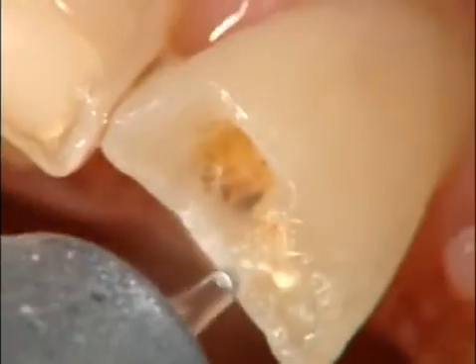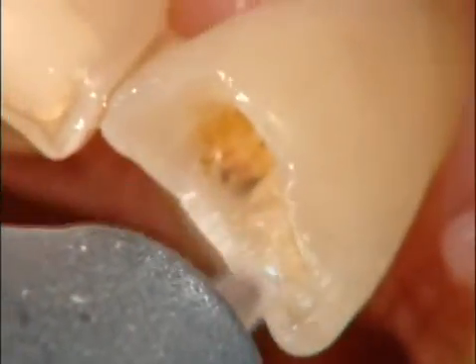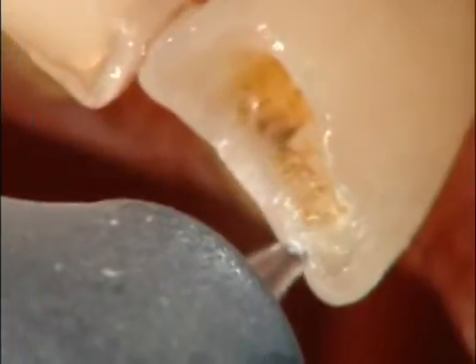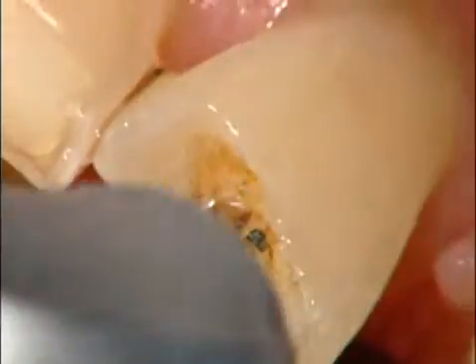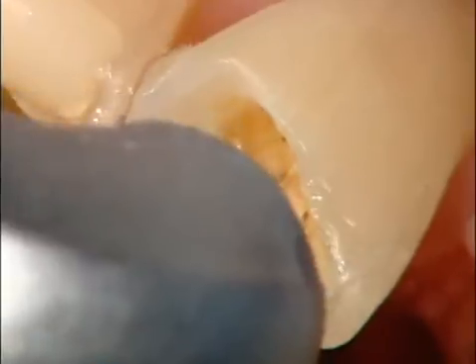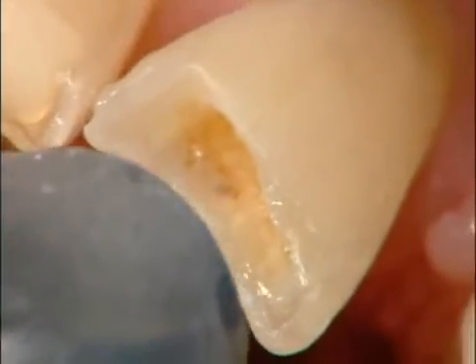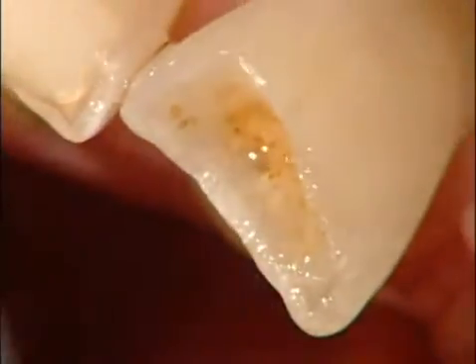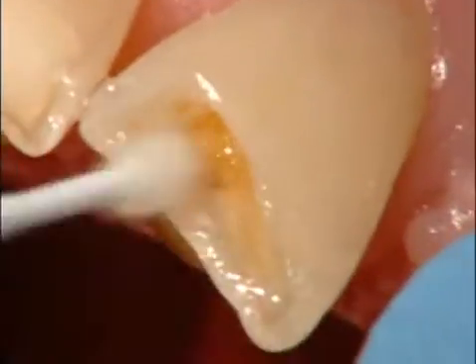I'll also put a little bit of retention, mesial and distal. And I find that when I use Clearfil self-etching primer and bond, it cleans up the enamel really well where the laser etches it. When you put your composite in on the finish, you don't have any white lines on the thinnest of enamel margins. Again, when the dentin is brown from using the laser, back off. That'll take the brown away. If you get too much white on the enamel, get closer and it'll clean the enamel margins up.